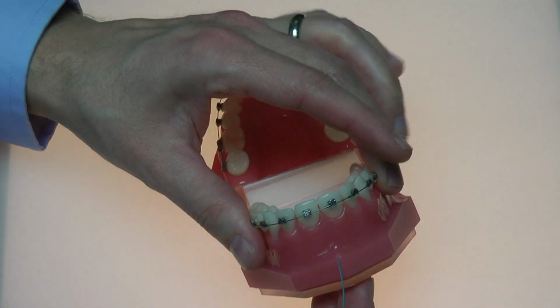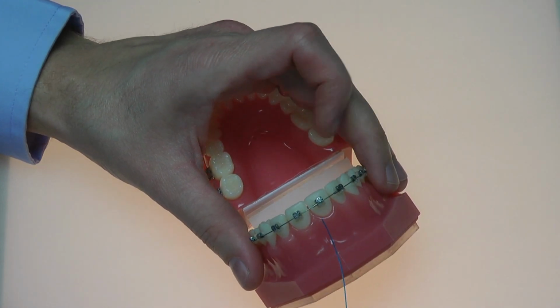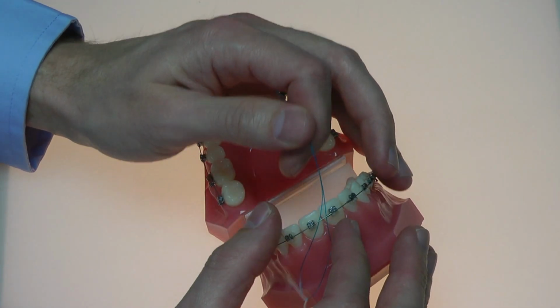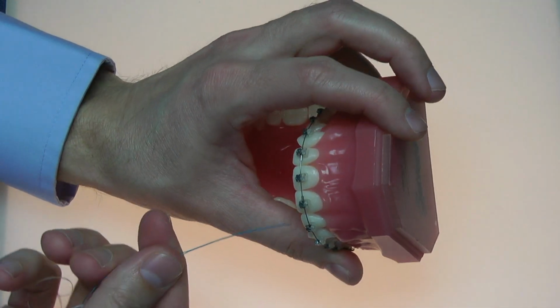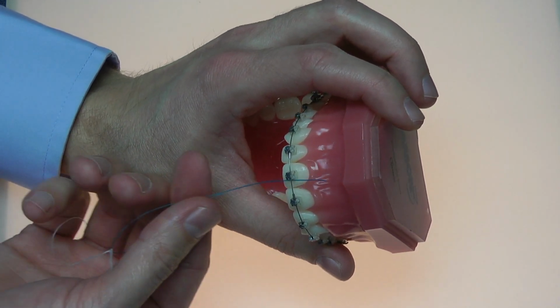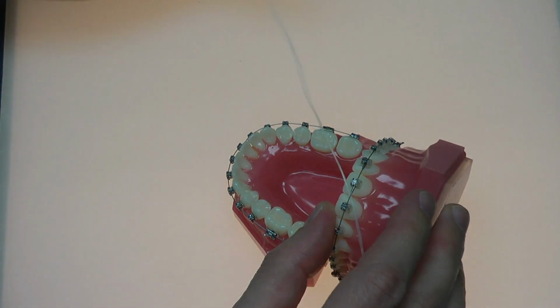Now, one thing I believe I forgot to mention: when you place the floss threader in, just like the brushing technique, you want to go from the gum side of your brackets and your wire down away from your gums when you put the floss threader in. That's just because when you floss, if you put the floss threader up this way, you're more likely to poke yourself in the gums, poke yourself under your lip. Something uncomfortable may happen, so you want to go from your gums down toward the inside of your mouth, and that'll make it easier for you.